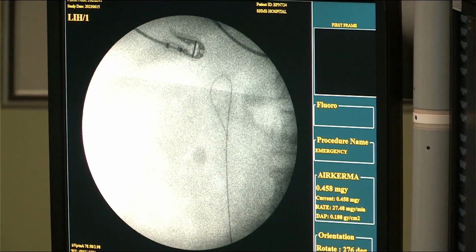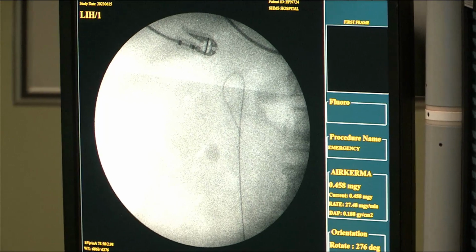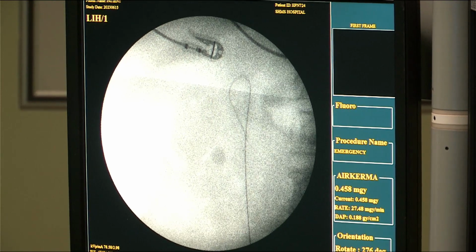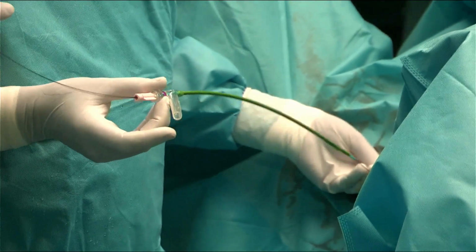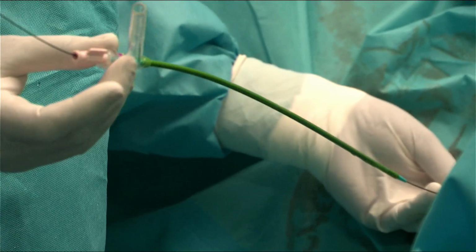Okay, so this is the X-ray. We have put the guide wire. You see the guide wire, sir? Yeah, beautiful. This time I'm using an Ester SS sheath. This Ester SS sheath comes with a suction. Show the suction channel. Kindly zoom in on the sheath. Yeah, so this is an SS sheath from Ester.